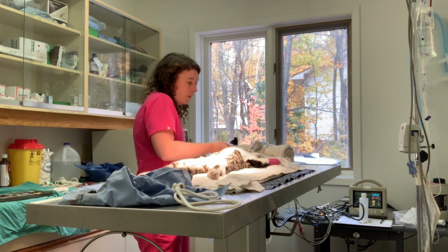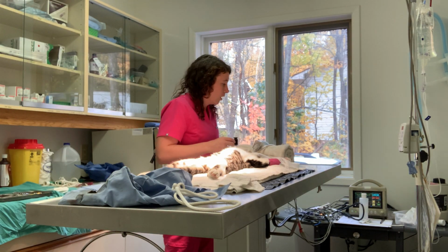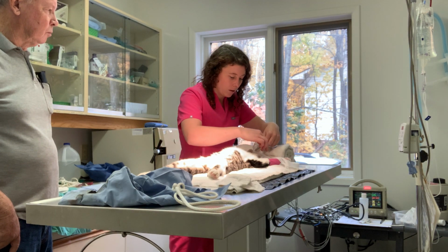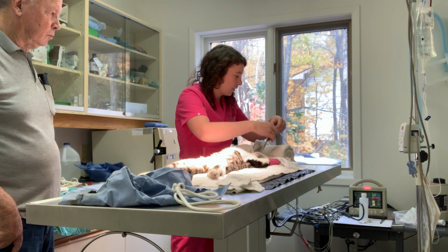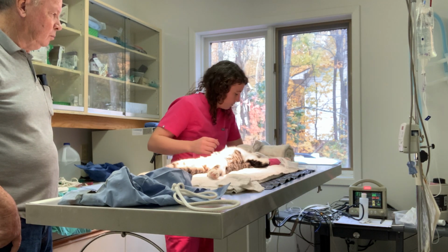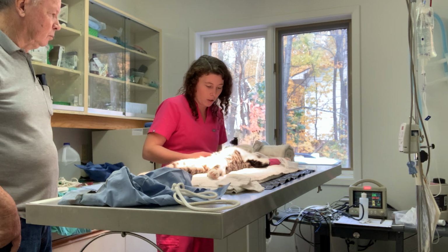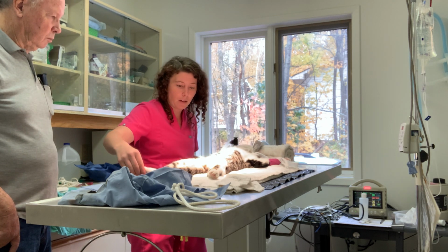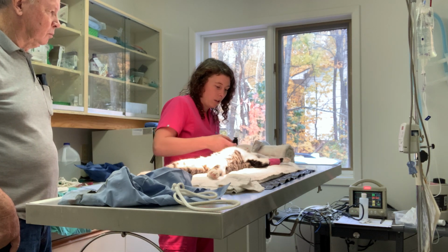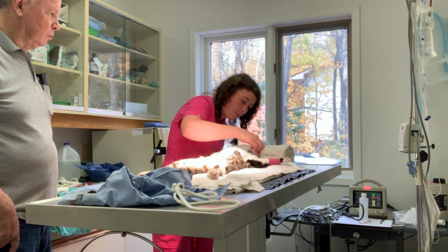Okay, then I can disconnect my SpO2, and so we're all good there. And then we can remove here our esophageal stethoscope. And we want to continue to monitor our patient, see if we have any refluxes. We want to make sure that our gauze is out of the way.